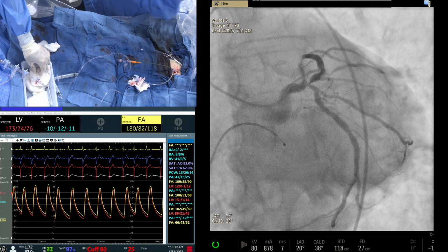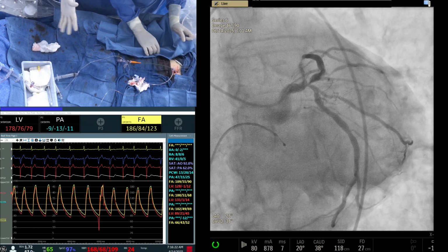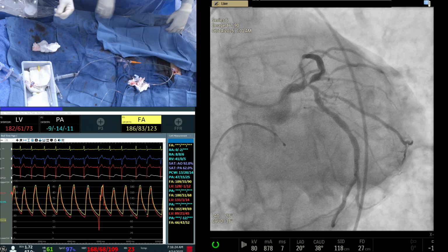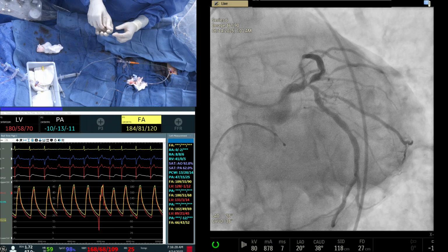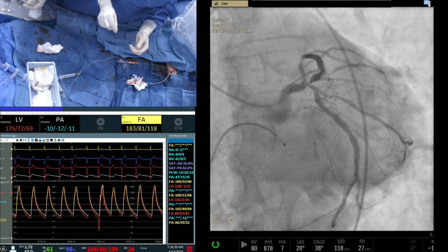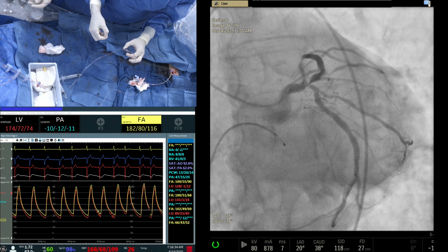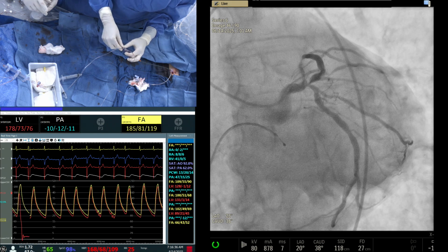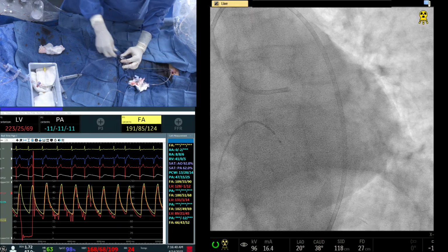And we are ready for it, and very calcific. I know IVUS can be done to decide or any other technique, but we'll try to do it. Let's go. Just do it without it, and then the question comes that how we are going to do with the two-stent approach. Should have been 1.75. Slow flow. That's okay. If need be, we can use the IVL ready. Also 3.5 if needed.